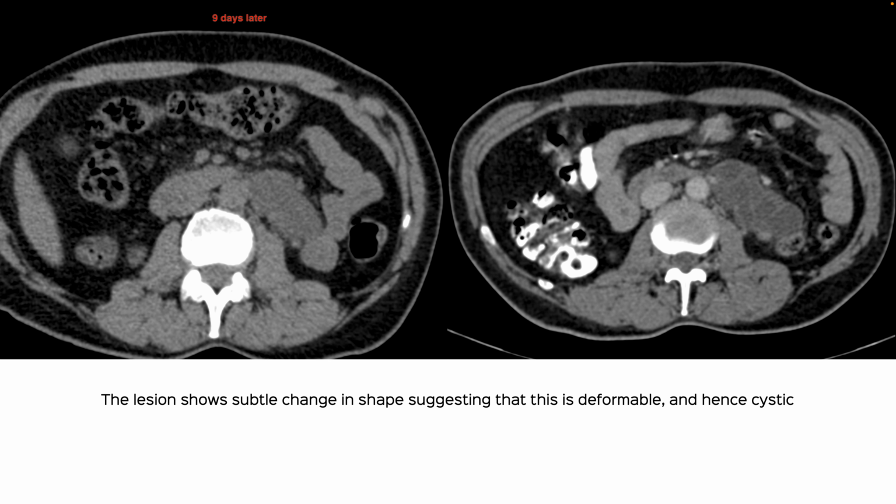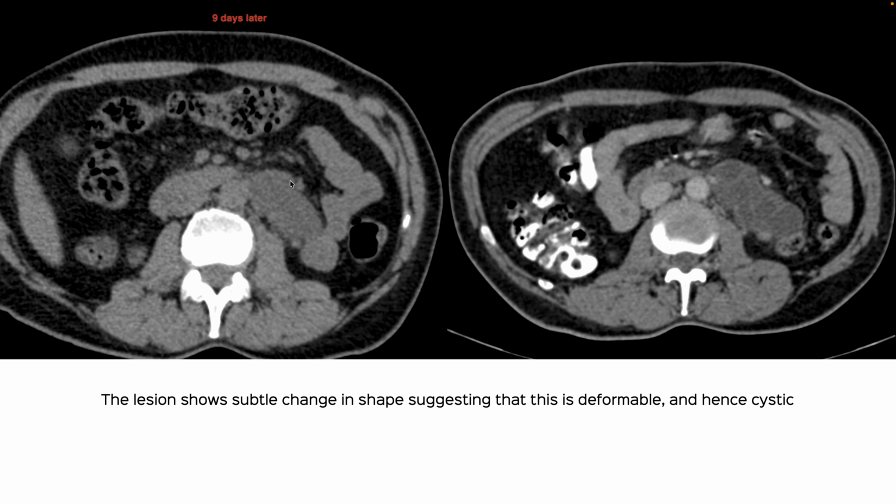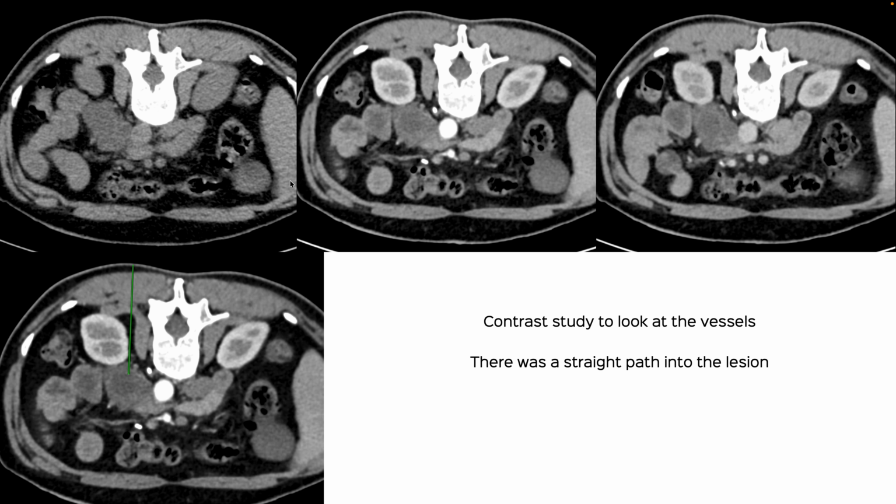Fat containing lesions can also be deformable, but it therefore confirmed the fact that this is just likely a benign cystic lesion. Initial thought was to do the biopsy in the supine position, but then I realized that prone would be better. And I gave contrast to make sure that we could identify the vessels clearly.